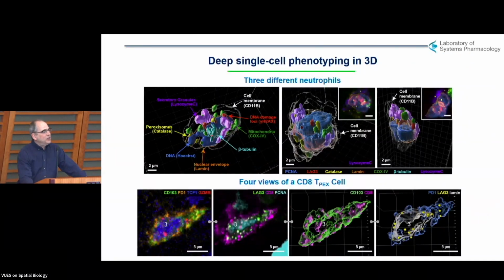If you go in and use high resolution imaging, these are just some reconstructed pictures, a mixture of pixel level data and the meshes that Nils introduced before, you can actually see a level of detail in individual human cells that have been 5 years in somebody's closet that you would not otherwise have noticed except in tissue culture experiments. So the capacity to push resolution here is largely unrealized.